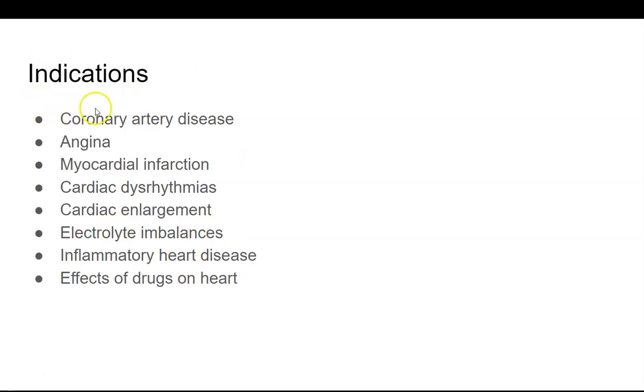So what are the indications? For all cardiac disorders, we can use ECG as a diagnostic tool, a very important diagnostic tool. Among cardiac diseases, coronary artery disease, where you can identify whether the coronary artery has any block, angina pectoris, myocardial infarction, cardiac dysrhythmia. When there is abnormal heart rhythm, you can identify it through the electrocardiogram.